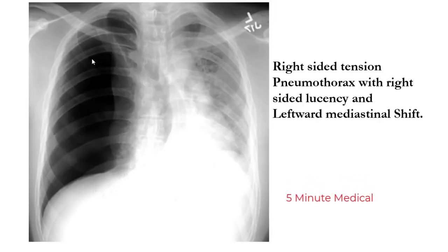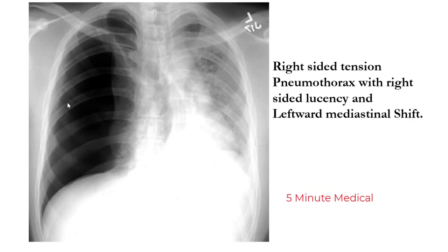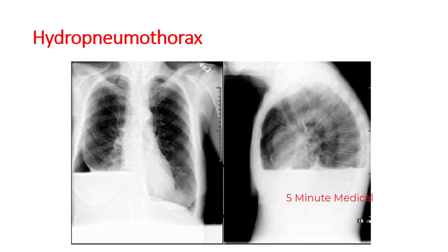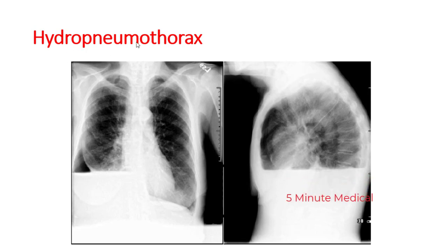Tension pneumothorax is best demonstrated on an expiration film. This lucency is due to entering air. Right-sided tension pneumothorax shows right-sided lucency with leftward mediastinal shift — very important. Hydropneumothorax, most commonly due to trauma, shows both air and fluid entering the pleural cavity.